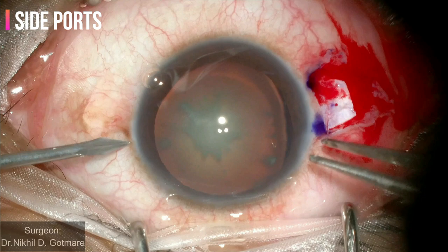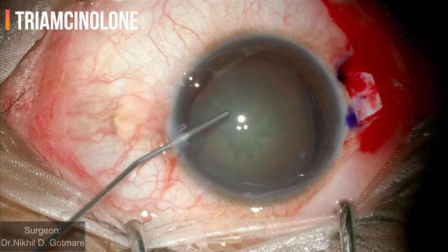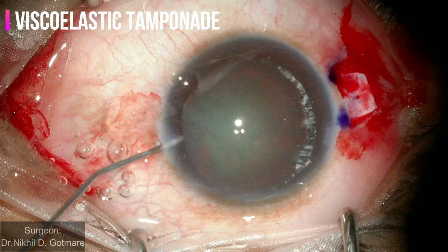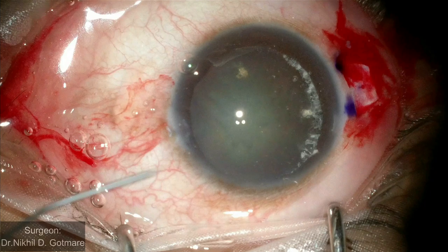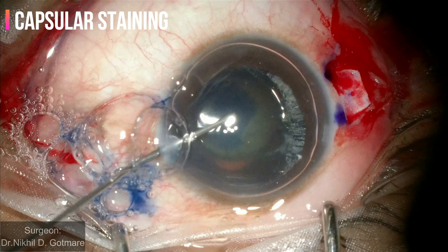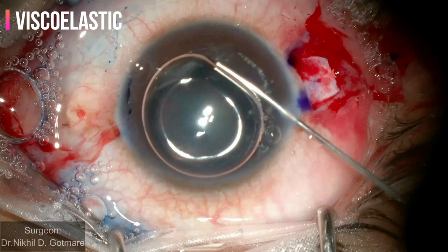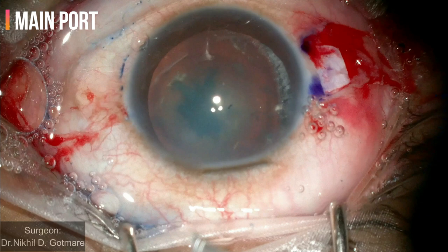Side port incisions are made at 10 o'clock and 3 o'clock position. Diluted triamcinolone is injected in the anterior chamber to look for any vitreous — there is no visible vitreous prolapse. Viscoelastic is injected in the area of subluxation as a tamponade to prevent herniation of vitreous and to prevent dye from going behind. The anterior capsule is stained under an air bubble with trypan blue dye. Excess dye is washed and AC is formed with high molecular weight cohesive viscoelastic. Main port is made at 12 o'clock using a 2.8 mm keratome.